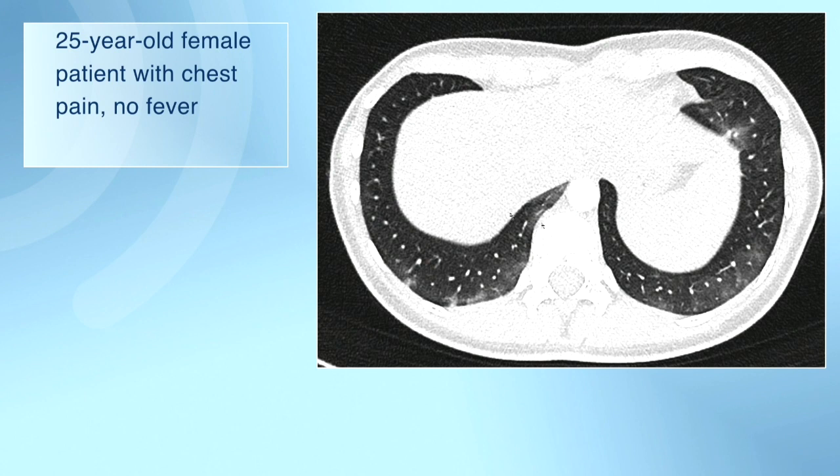You see, this is normal lung parenchyma. See these dark areas, this is normal lung parenchyma. And you see, not better here on the left side than on the right side, an increase in lung density. As you still see vessels here, that's what we call in radiology ground glass. So whenever you read in literature ground glass opacity, that's what it is. You see an increase in density with the preserved visibility of vessels.